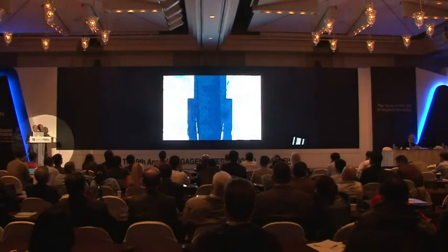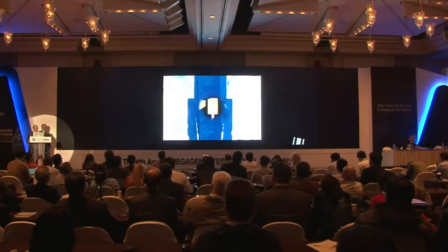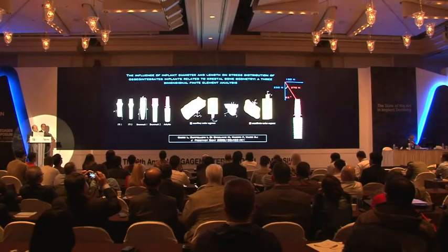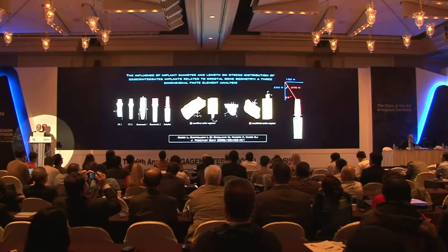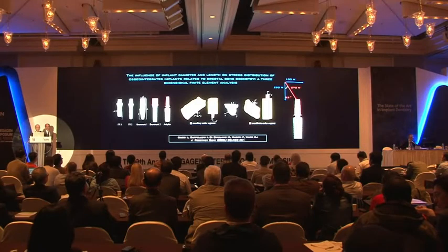This is what we want. The histological sample shows that it is really possible to have bone on the platform. But, in fact, in our work of 2008 in the Journal of Prosthetic Dentistry, we compared the biomechanical performance between traditional implants with a resorption cone and implants with conical interface and subcrestal positioning with bone on the platform.